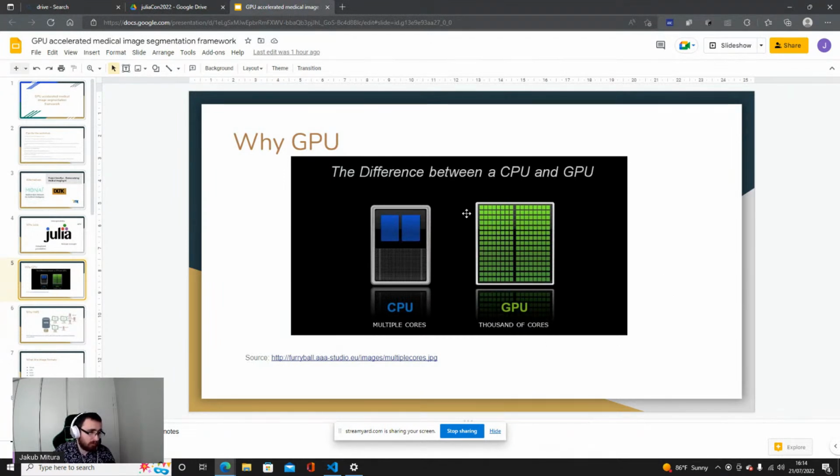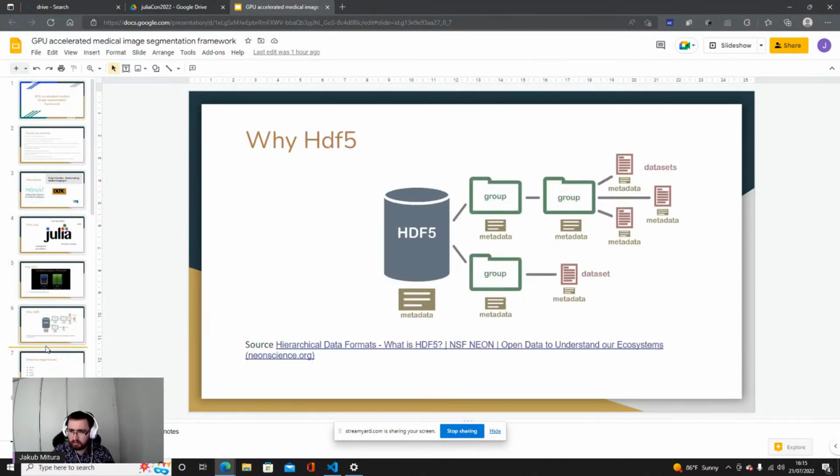That's why GPU, where we have a lot of threads, has some limitations, of course, but a GPU can generally have thousands of cores. CPUs usually have 8, 16, 32, and in the very top end, let's say, more. Normal GPUs can have thousands of cores, and this is a game changer for this type of data. When you are working with such huge data arrays, this will change the speed of execution 100-fold, even more. Sometimes I have seen algorithms that were 1000 times faster thanks to GPU.